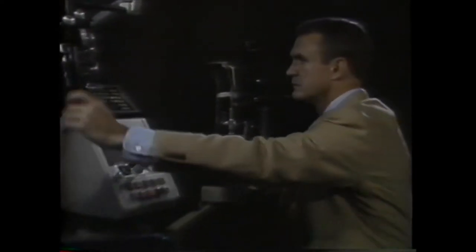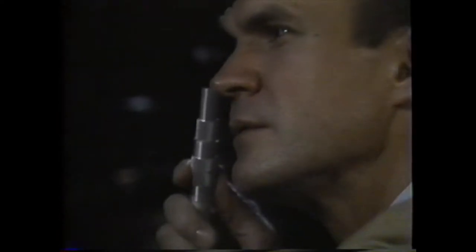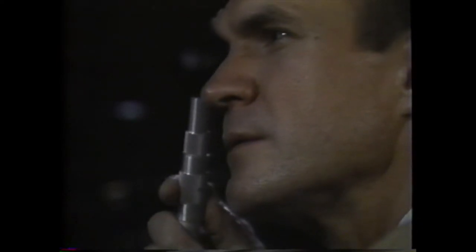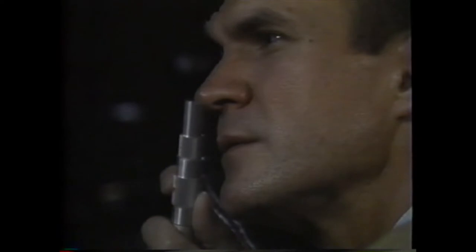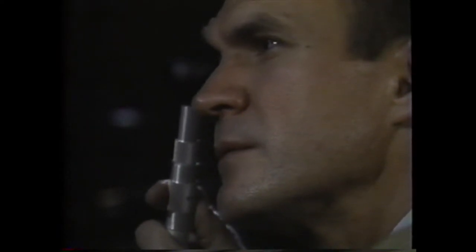Dim the lights and look for with or against movement, this time not only holding the sleeve all the way up, but also rotating it with thumb and forefinger to change the streak from one meridian to another as you sweep the intercept across the pupil. Note that the reflex is different in different meridians, indicating the presence of astigmatism.